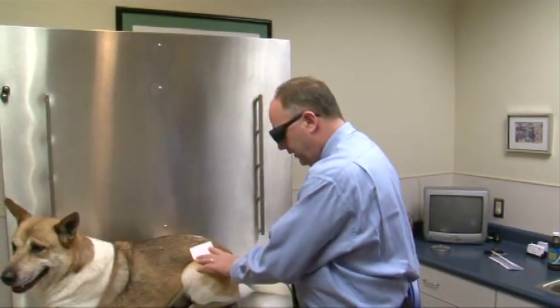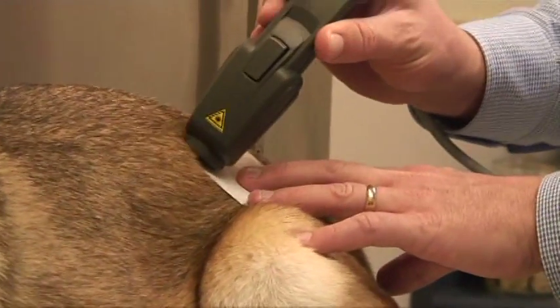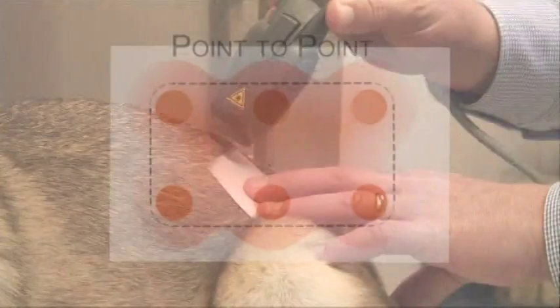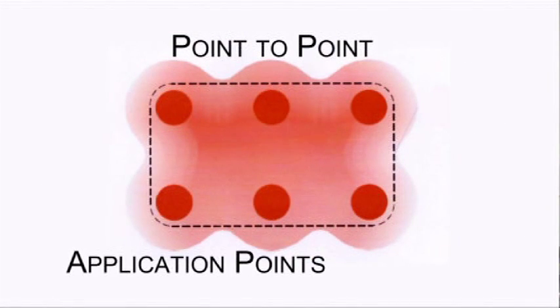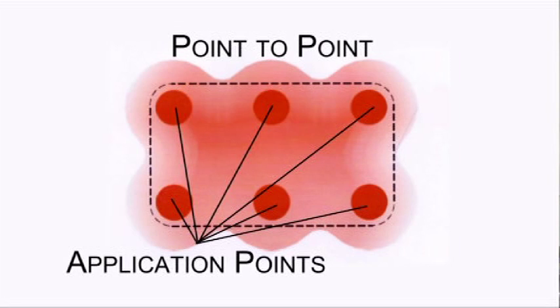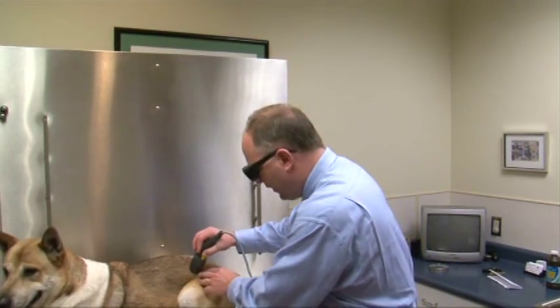Looking at this particular patient and the area I'm going to treat, in point-to-point mode I'm going to be delivering the energy using 6 particular treatment areas. The probe will not be moved around or across the patient. I would take the treatment time of 3 minutes and divide by 6, so I'll be at 30 seconds for each particular point.